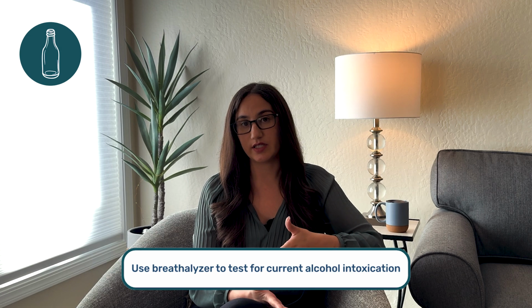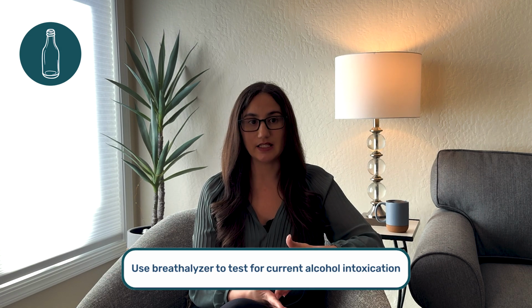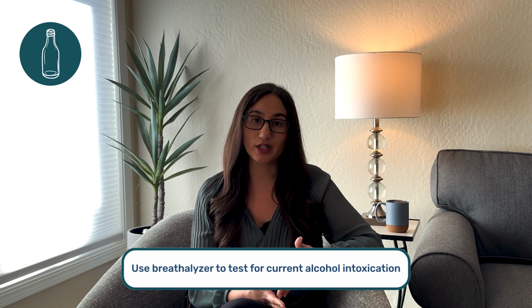Now, if alcohol is one of your main concerns for your child, a breathalyzer is going to be the recommended test for current intoxication. The reason is that drug screens can only tell us if the substance is present within the system. It cannot tell us current intoxication.